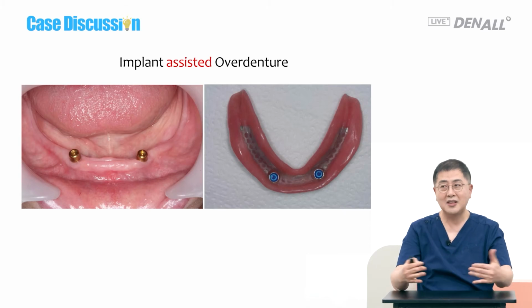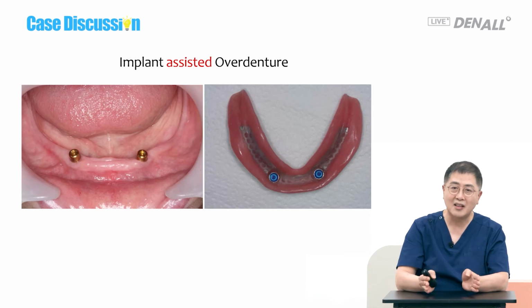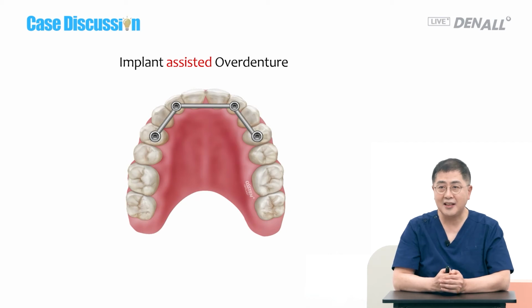Full denture is difficult in mandible, so the answer for that is placing two implants on mandible like this. Locators or other attachments can be used. If you have a small number of implants, for the maxillary overdenture, that is the issue.